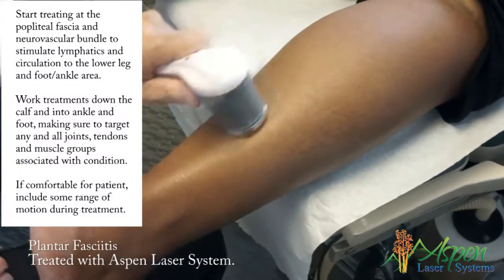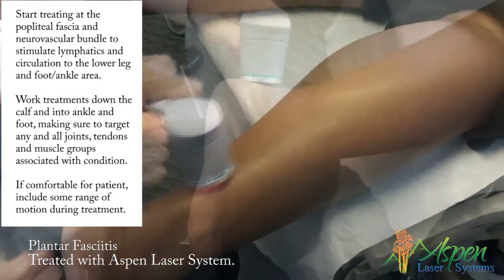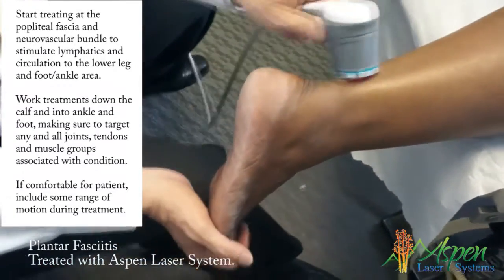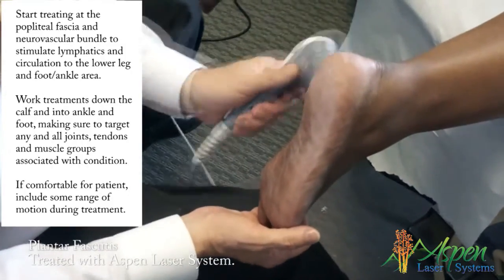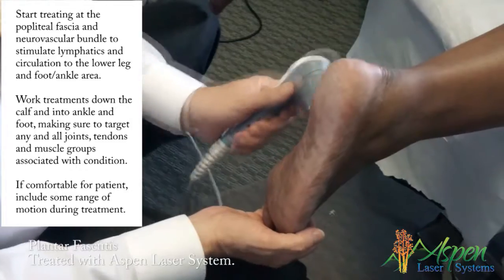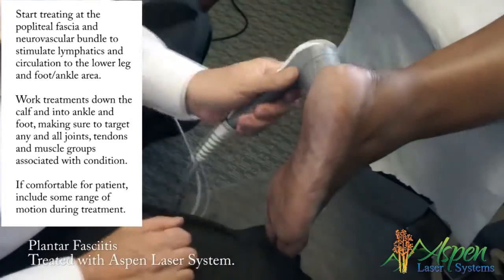I'll do the soleus. If it gets too warm or ticklish, let me know. I'll do the posterior tibial — looks a little off. What do you think the delineation is?